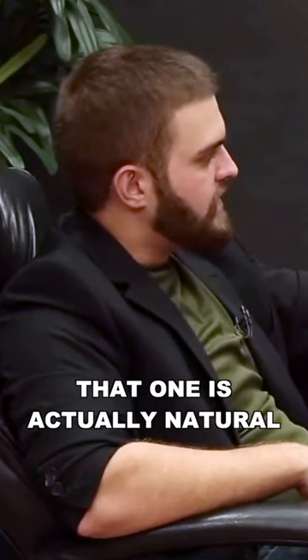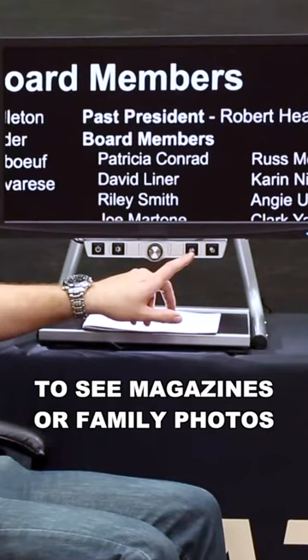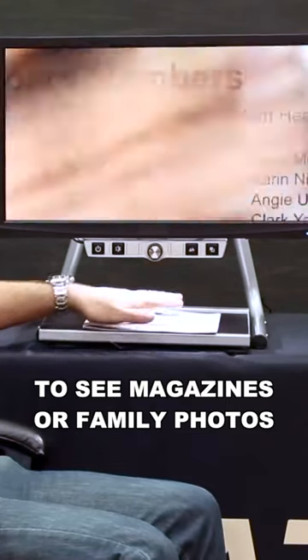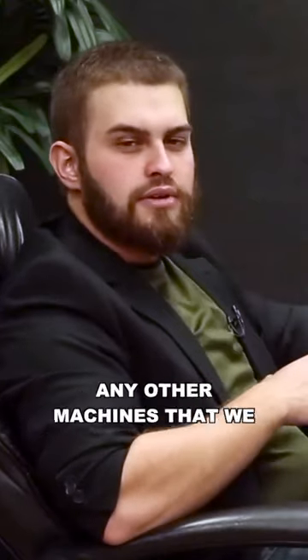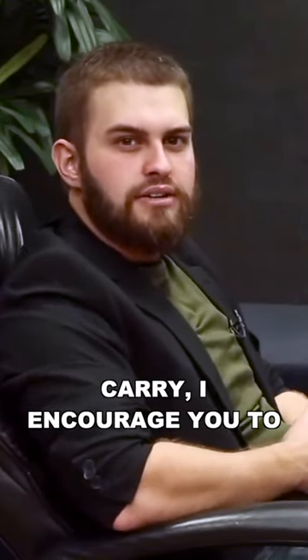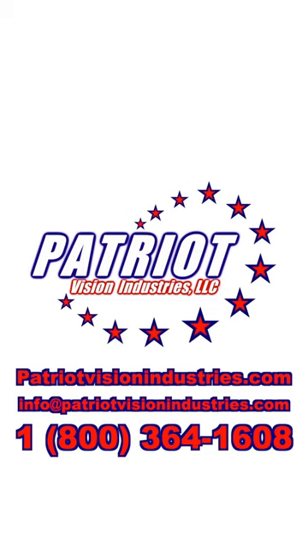The button right next to that one is actually natural color, so you can get back to seeing magazines or family photos or something underneath it. If you have any questions about the Patriot Titan or any other machines that we carry, I encourage you to call me. You could also check out our website, patriotvisionindustries.com. Thank you so much, my name is Charles Palmer — have a great day.